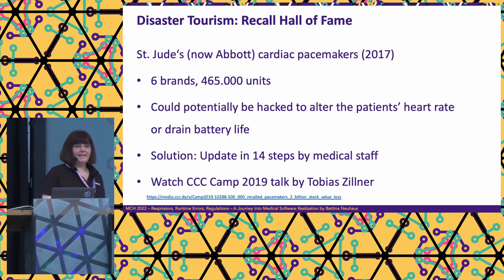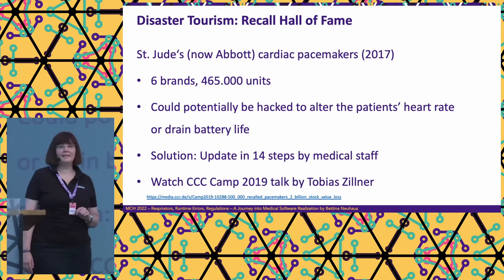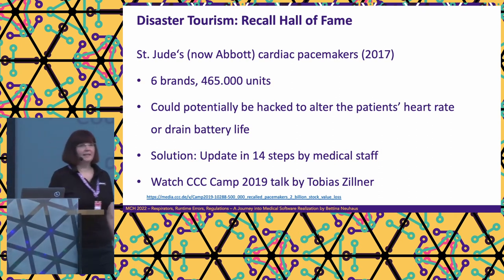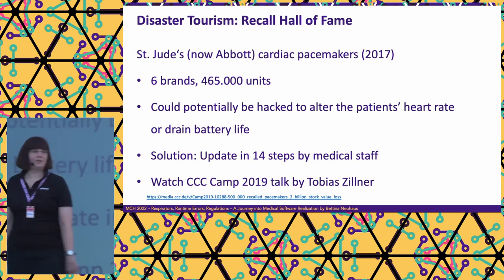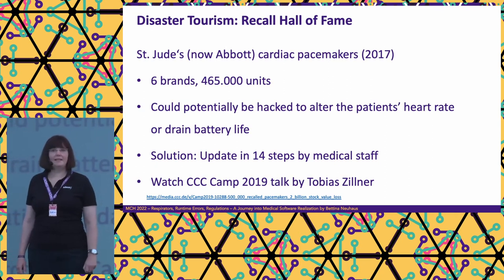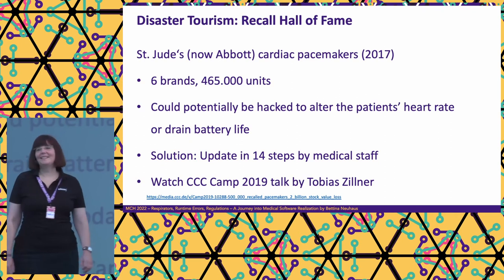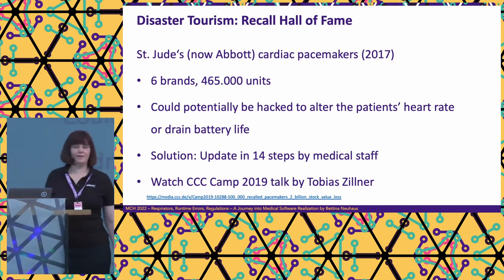Also, a very nice example, I love it so much because there was a very interesting talk at the last CCC camp. The link is down here. I highly recommend to watch it. This was a pacemaker and it could be hacked. And you could change the heart rate of the patients. Or you can drain the battery quicker than they wanted to. And interestingly, the manufacturer tried to say for some time, no, it works, it's not true, but well, just watch that talk. It's really good what they did. In the end, they had to recall all these.